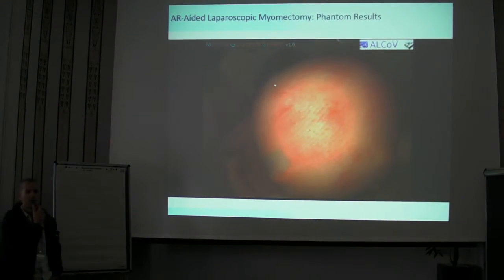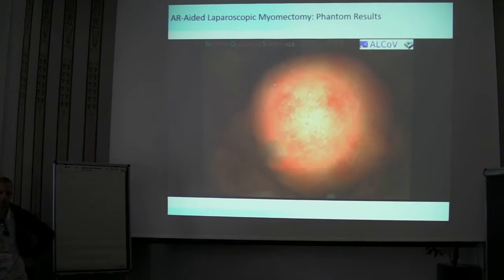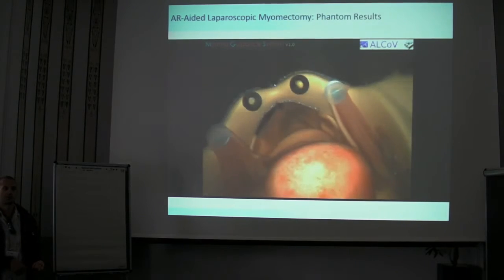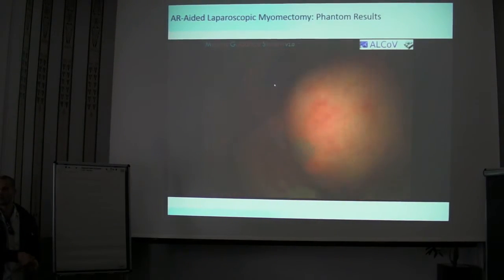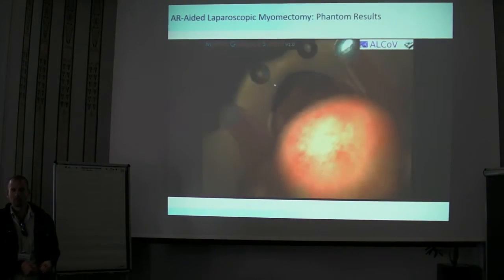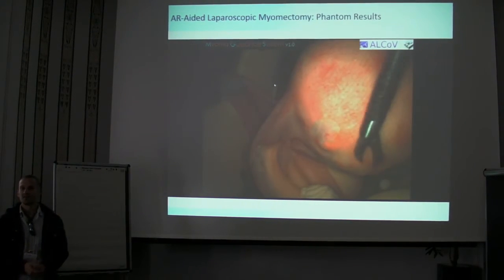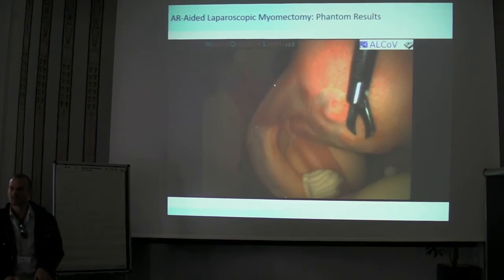So that was going well. And we did some tests with the residents at the hospital, and that was very funny, because what we were doing was simulating the MRI. We would show them the MRI, and then they had a phantom, and they had to point with some tool where they thought the tumor was on the phantom. Then we would turn on the AR system, and they would confirm or not whether the place they had pointed to was correct. And some of them didn't want to do it. It was very funny, especially the more experienced surgeons in front of all the beginners. They didn't want to take the chance of missing the tumor.